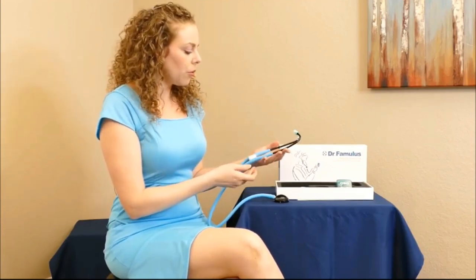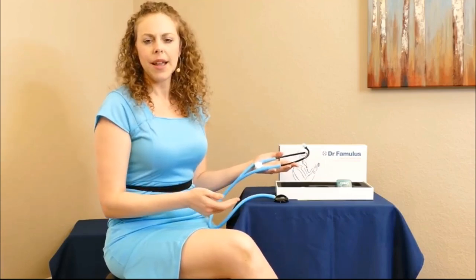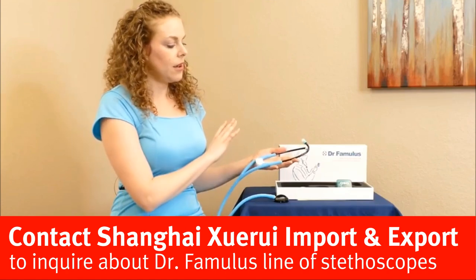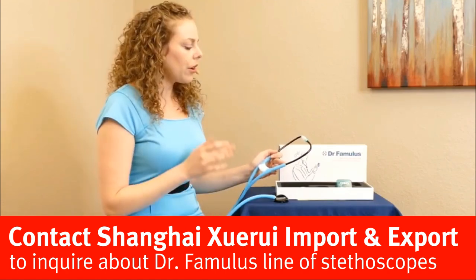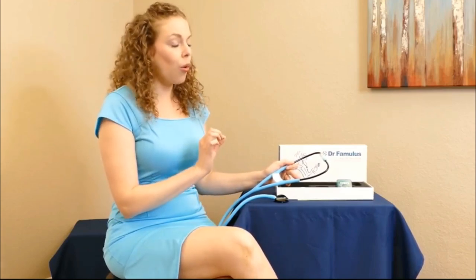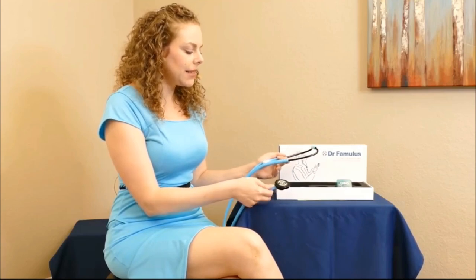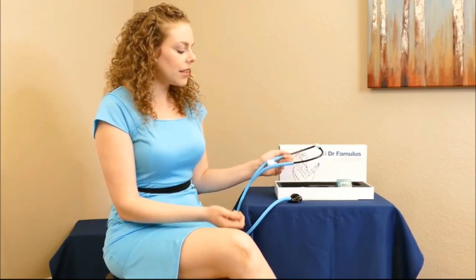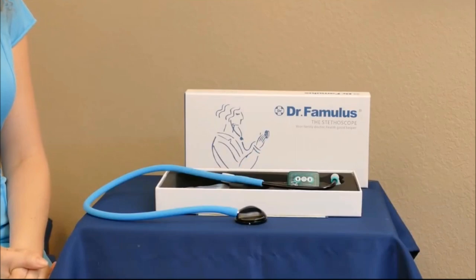It's in the mid price range — you can find stethoscopes that cost more than twice this, but while there are cheaper options, I think this is a great quality for the price. In terms of usability, it's easy to use, easy to clean, and all of the maintenance details are laid out really clearly in the instructions. I think this is a great piece of equipment, whether for professionals or for home use as well.